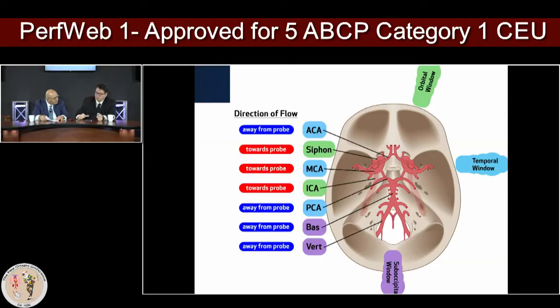So the TAVR is more challenging because we started with a patient population average age of 85, 80. And especially the ladies, it's not a sexist comment, but suddenly we noticed that it's really hard to get through the ladies' skull. Probably the osteoporotic air pockets are blocking our ultrasound to get through the bone. This is why we came up with a solution that the submandibular ICAs, it's a good solution to really look and monitor those cases if you can't get the signal through the transtemporal bone.